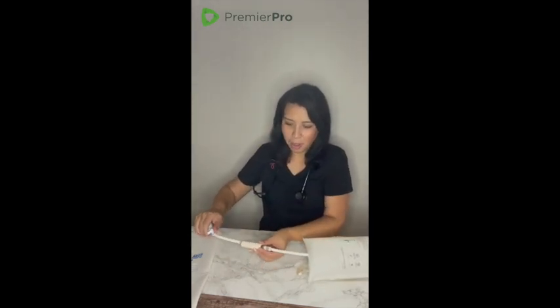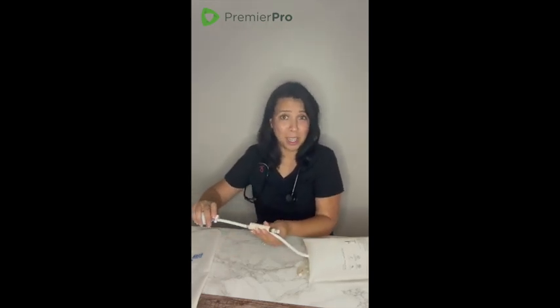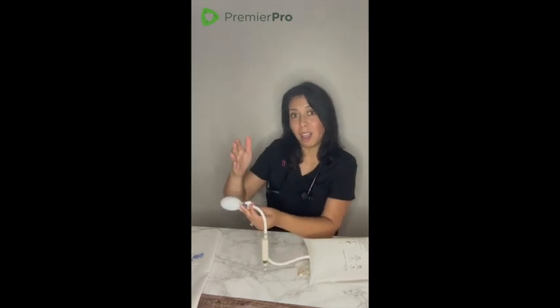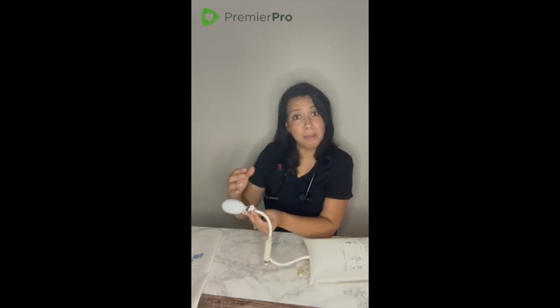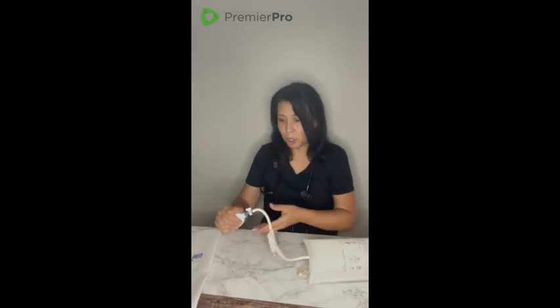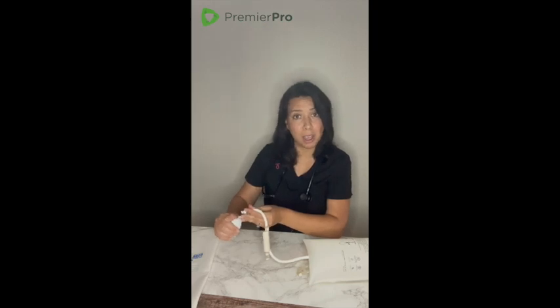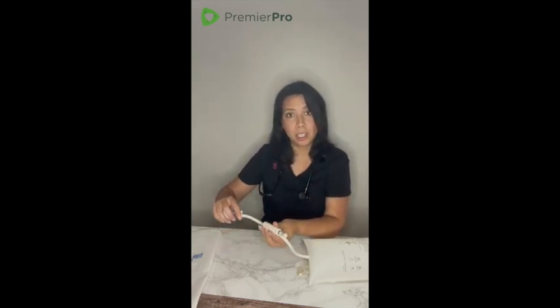All right. Now that I know I may have overinflated a little too much, there's something that I can do. Just like we turned it to the proper position for inflate, we turned it to maintain pressure. If you need to deflate the bag, you can turn it down straight towards the inflation bulb, the tail of the stopcock, and air will release from the bag. And then you can turn it back to the proper position if you want to inflate some more, get it back into that green zone. And now I'm going to turn it to maintain that pressure.